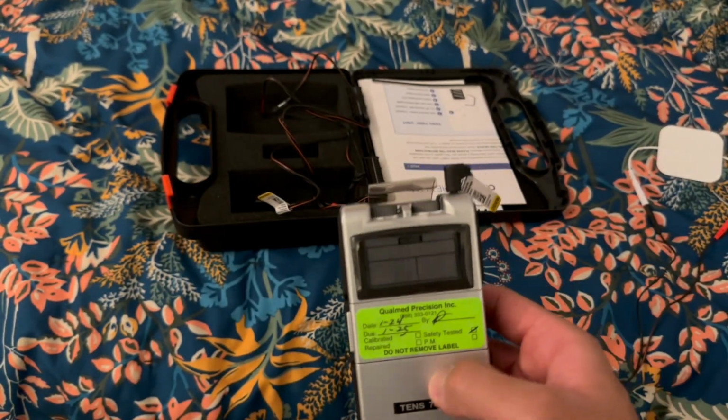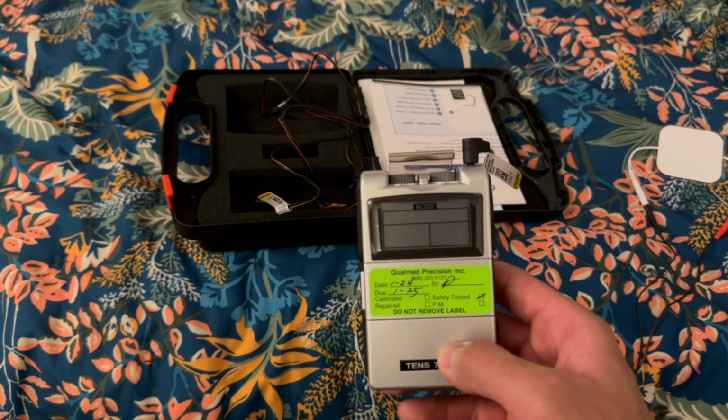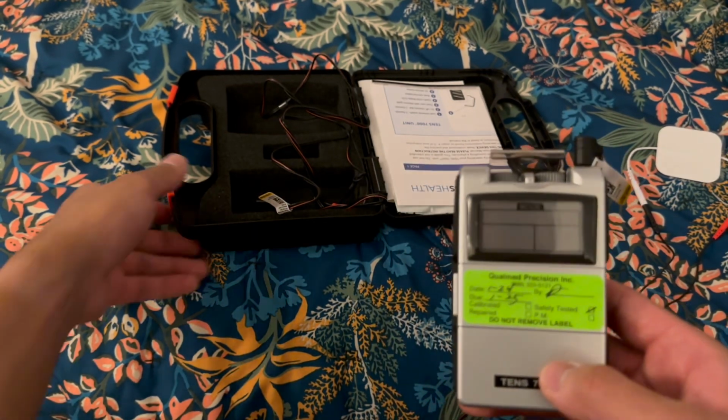And then before we place it on the patient, we'll go ahead and wipe the area with alcohol. Today I'll go ahead and treat my shoulder in a brief demonstration. So my treatment area is going to be my shoulder, so I'll take my scrub top off, and then I'm going to use this alcohol wipe to remove any sweat, dirt, debris, whatever could interfere with our electric pad, and it just keeps the area clean for stronger electrical stimuluses to be sent. Just wipe the area real quick.